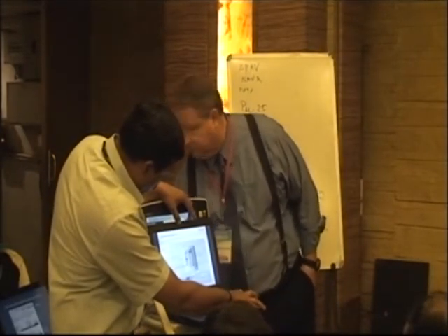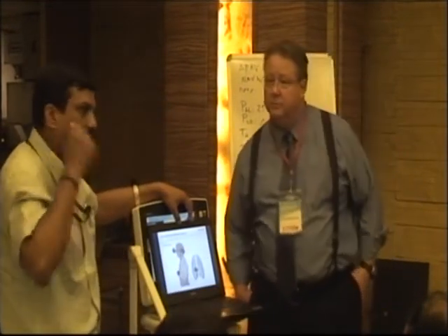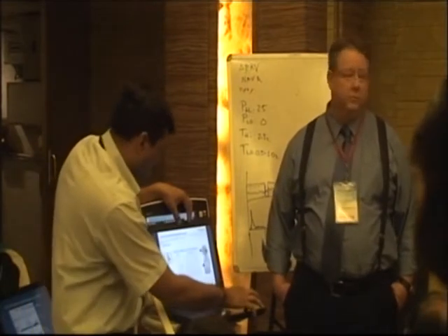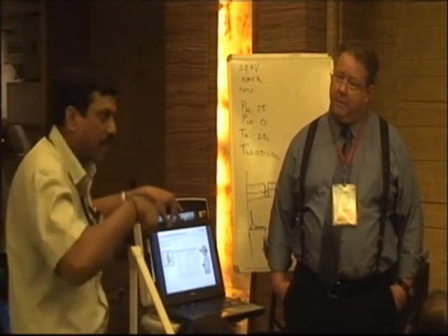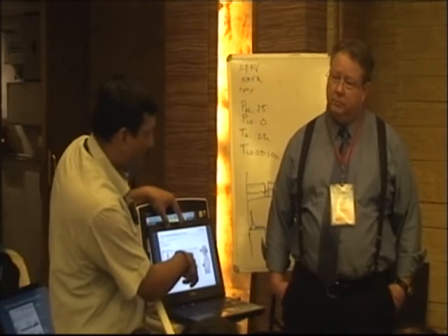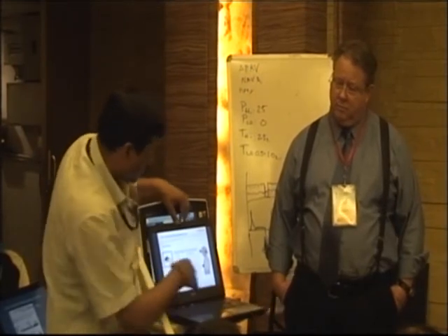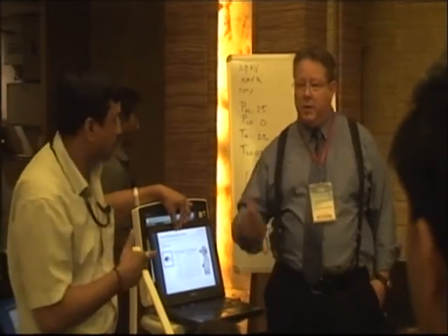And then we need to measure the NEX length: nose, ear and xiphoid. How much length we have to put the catheter in, we will come to know from this measurement. This is the multiplication for the centimeters to which we have to put the catheter. If you are going through the nasal route, then the NEX value is multiplied by 0.9 and we add 18 for 16 French, that is for adults. In oral it is 0.8.